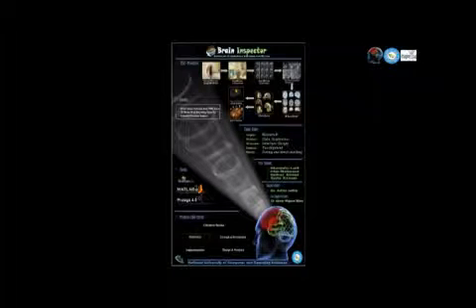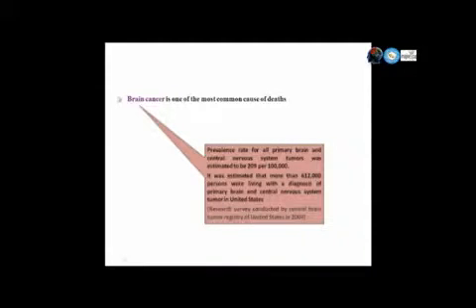detection and 3D visualization from brain MRI scans. According to a research survey conducted by the Central Brain Tumor Registry of the United States, the prevalence rate for all primary brain and central nervous system tumors was estimated to be 209 per 100,000 in 2004. This is year 2010, and the numbers are still increasing by every passing moment.